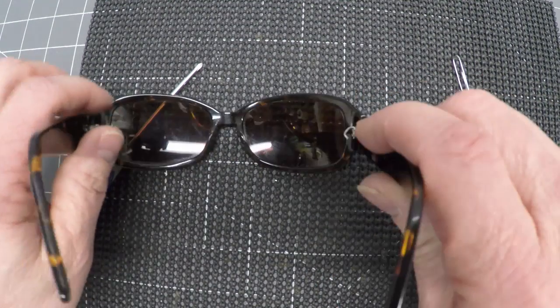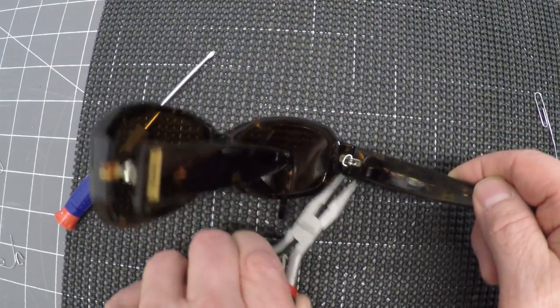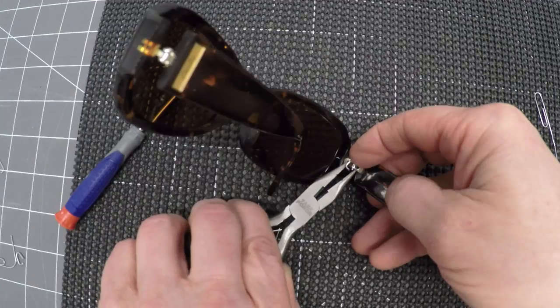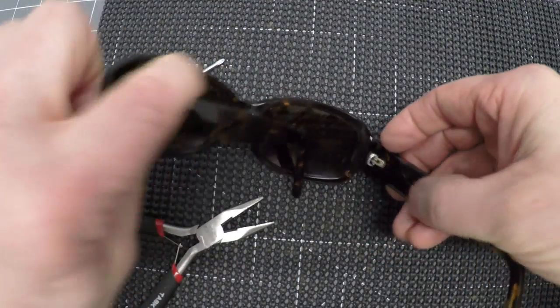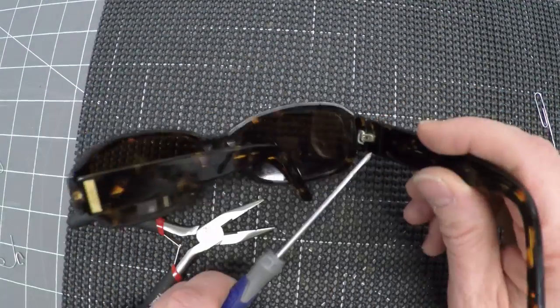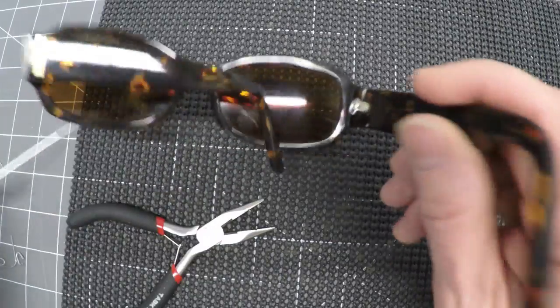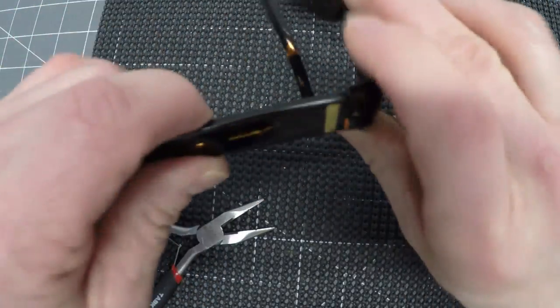And now you have an open D. So you take your pliers and just slowly and carefully put them together like this. This D is backwards in this case because it's the right side. And there, you finish the D. And I would say better than new. It's not gonna back out like that screw. And you can see it's pretty much concealed in these glasses.